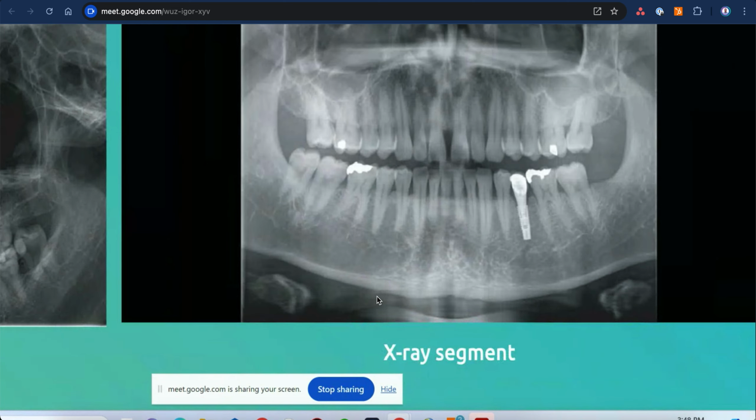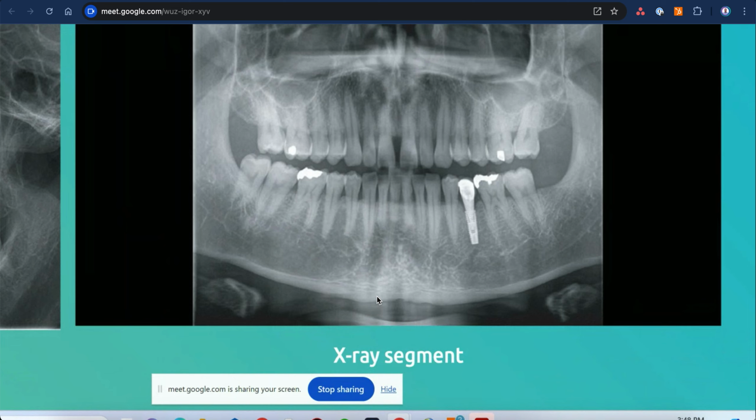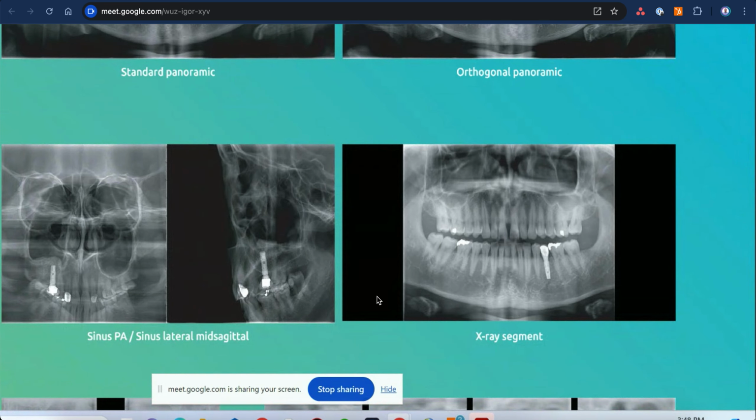Now this is the X-ray segment. For example, I can get two more. This is exactly the same as the panorama above, the same thing, but just a segment of it. Yes, just a segment of it.